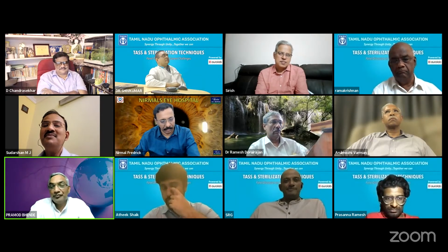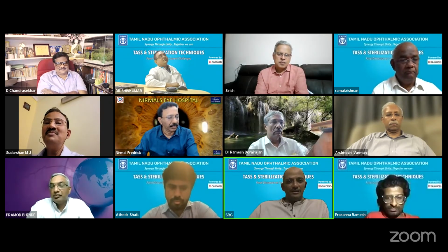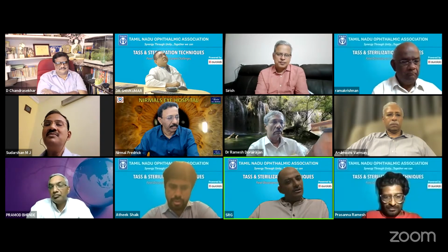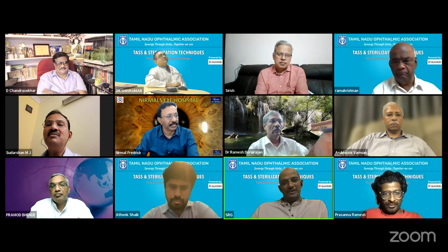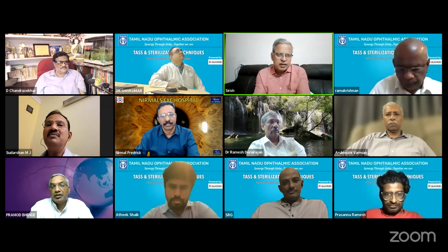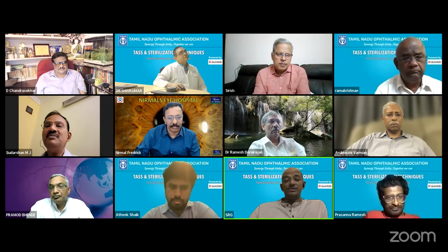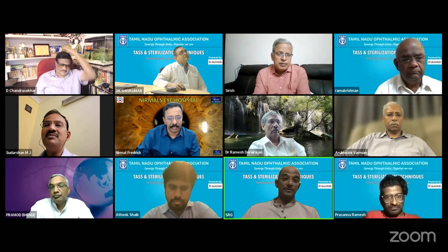And I have a question to what Dr. Sirish said. Dr. Sirish, you said you're using distilled water for your autoclave. Without ions, the autoclave process itself is more difficult. Haven't you faced that situation? Is it so? I have not. Even autoclave companies, they don't really advise us to use water without ions. No, they may not advise.